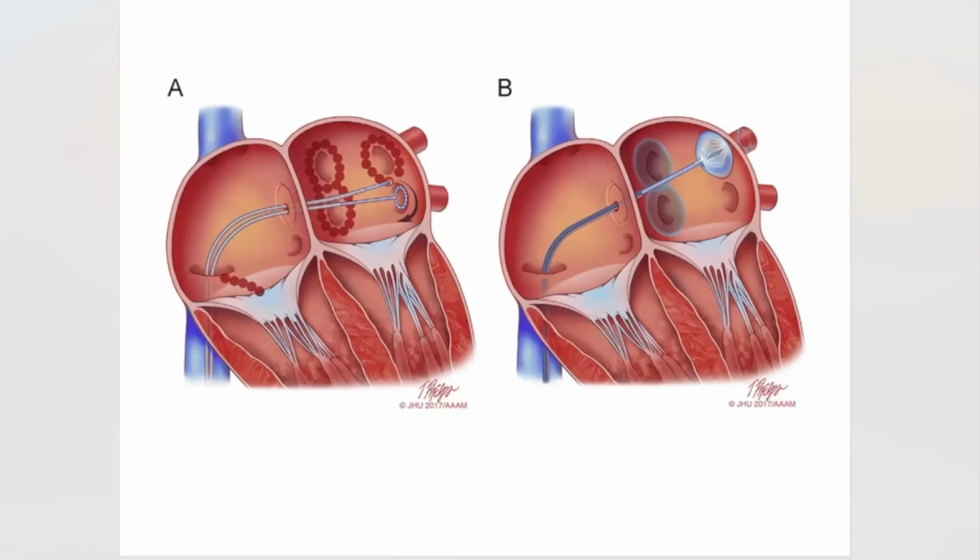Yeah, we talked a little bit about ablation already, and essentially the technologies we're talking about involve us putting catheters, thin wires into your heart through the vein in the groin. Typically we put you to sleep when we do it, put some freezing around the vein in the groin, put the catheters up to the heart, get them into the left upper chamber.